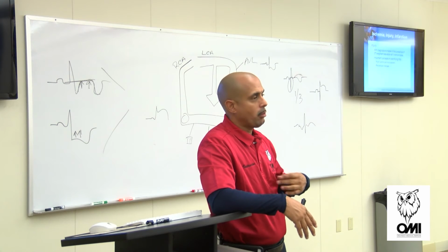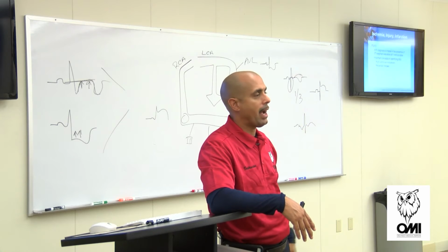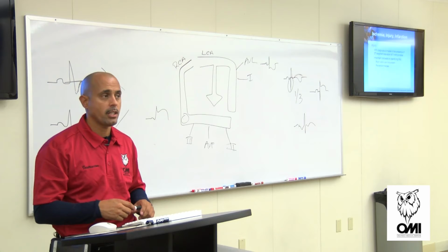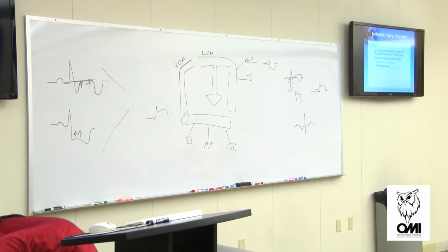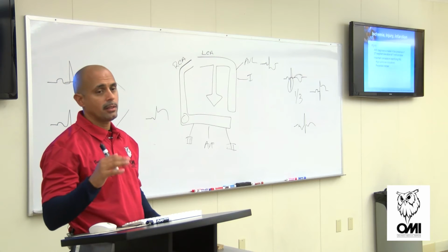But we normally do it the other way around. If I have depression here, it'll prompt me to go to the back to say, hey, this could be reciprocal. Make sense? That's what reciprocal changes are. So reciprocal changes truly help me identify, is this true ST elevation or not? I don't want to be caught with my pants down.